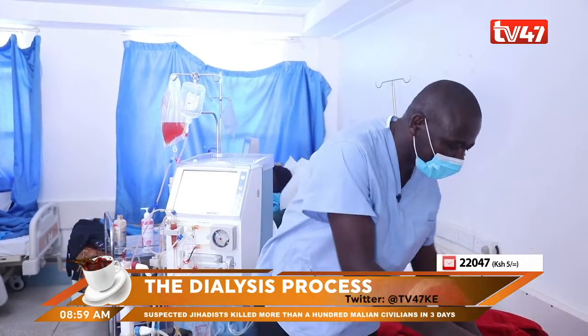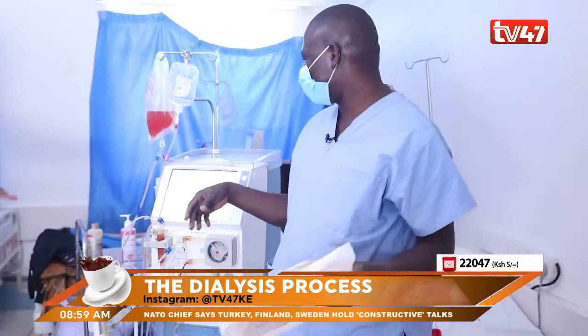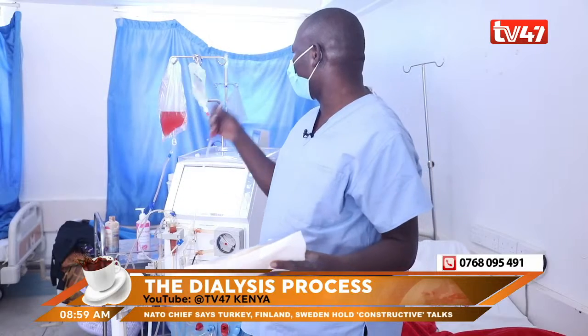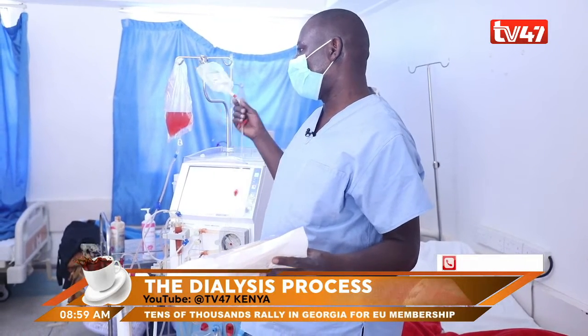And also this is what is called the bloodline. Yes, the lines, these ones that you were talking about. This is where the blood is going to pass, from this red one. This removes the blood from the patient.